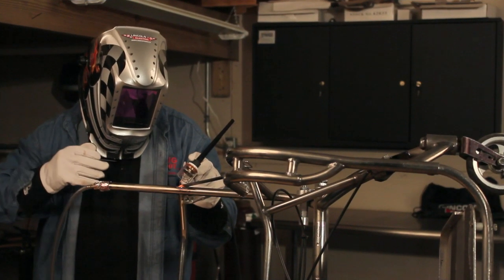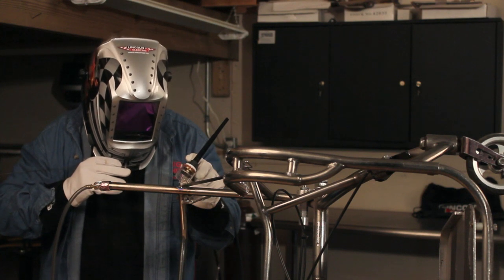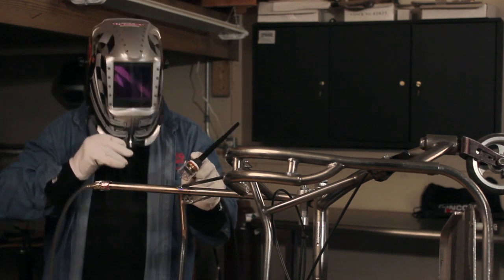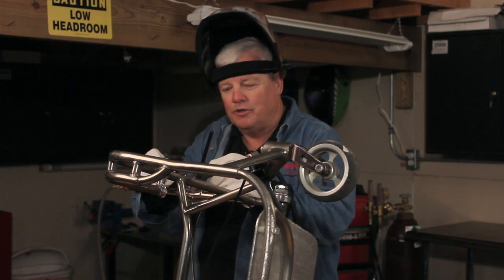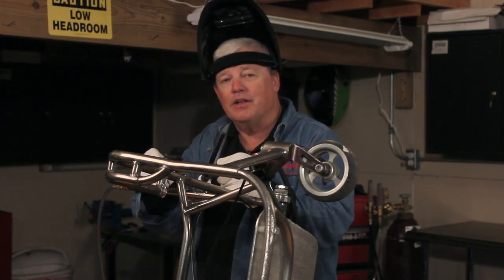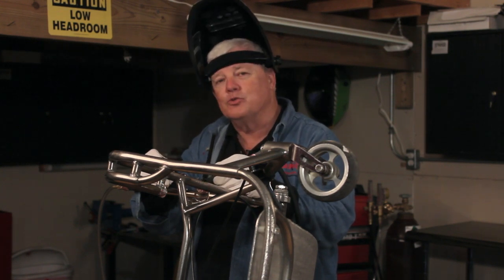I'm using probably 50 to 60 amps on this, so it's going to get hotter quicker — this is about the maximum you're going to want to weld with this setup. This wheelchair is owned by a person by the name of Wayne Romero, and he's using his old wheelchair right now, so we're going to finish this up, clean it up for him, and deliver it to his house this evening.